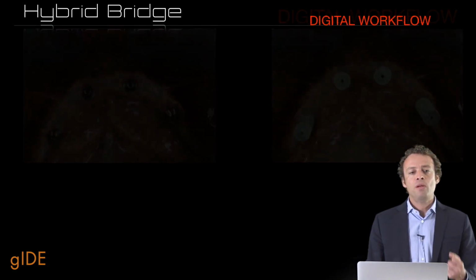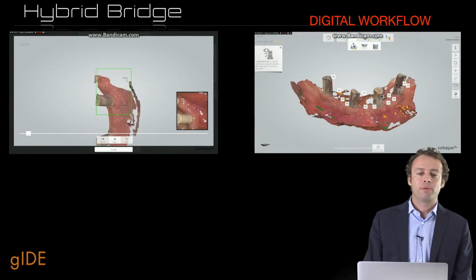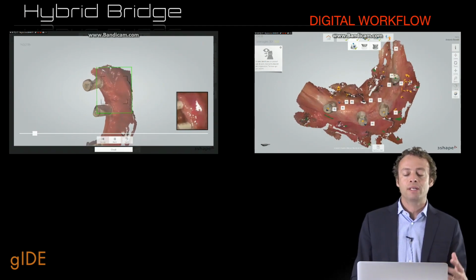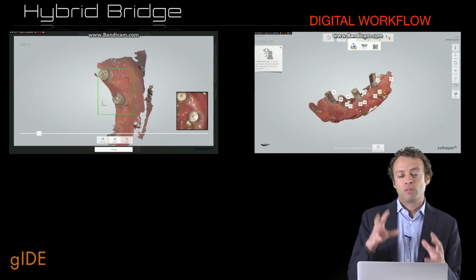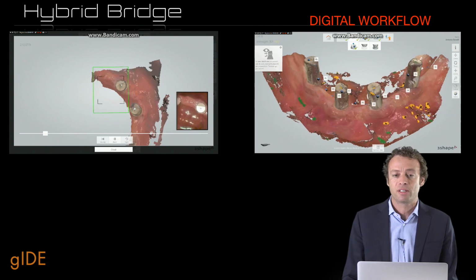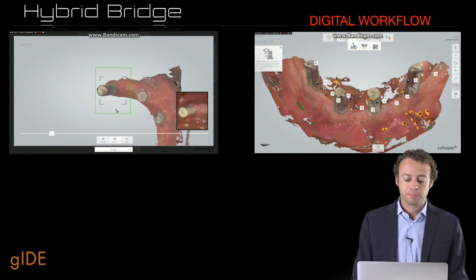The problem is that when we work with an intraoral scanning in case of a full edentulous patient, the reliability of the impression technique is not so easy to achieve, because it depends on many aspects. Because you know that when we work with intraoral scan, it's important from the software standpoint to have reference inside the mouth. And if we don't have teeth, we don't have a lot of reference. So it depends on many anatomical aspects if the intraoral scanning can be reliable or not.